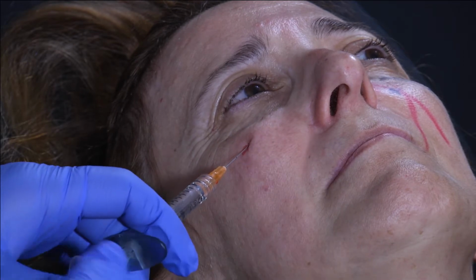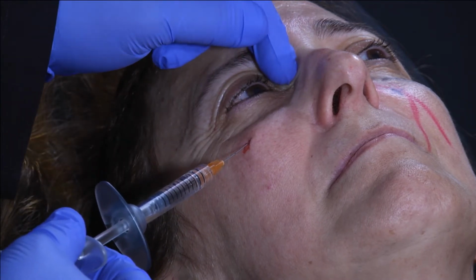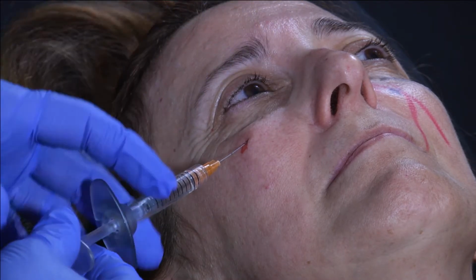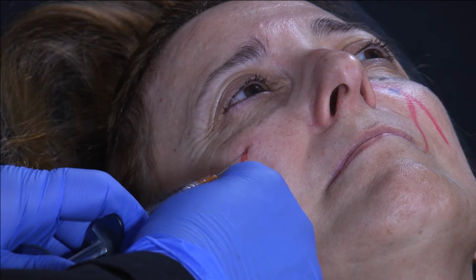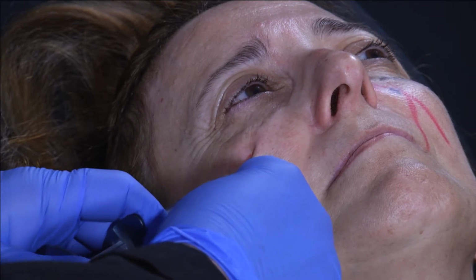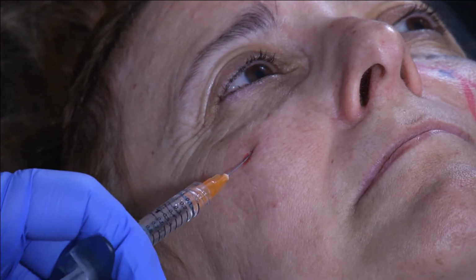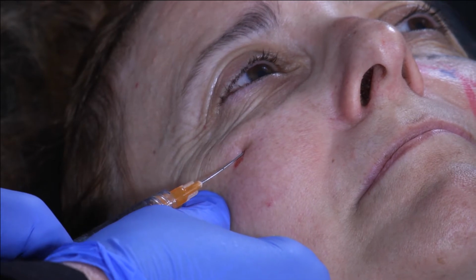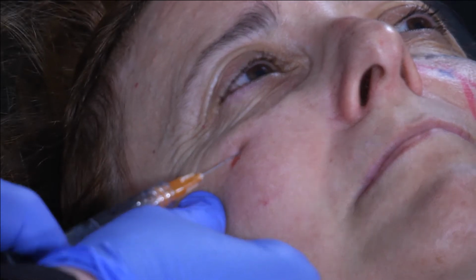So it means that with my cannula, I'm just here, at the top. It's for that I took a 50 millimeters cannula. And then when I withdraw, I will inject slowly my product. So here, you see I'm at the top. And after, I will do the nasojugal groove. I'm very safe because I'm deep, and I slide on the bone so it's easy.